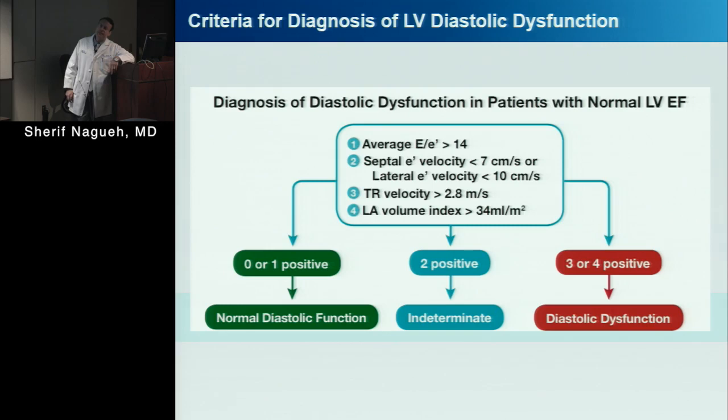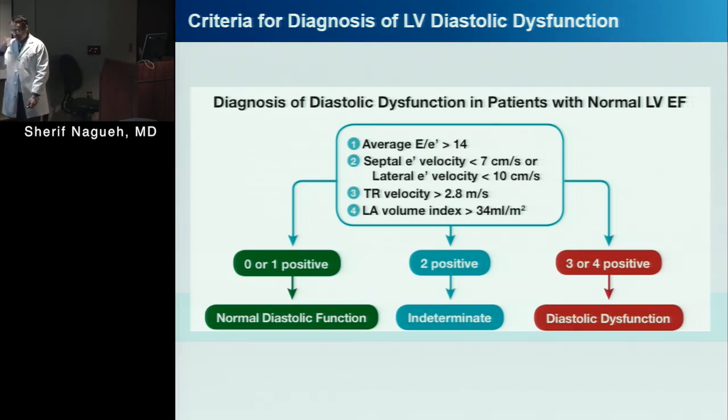The way I see that slide, that is not criteria for diastolic dysfunction. That's criteria for elevated filling pressures. So you have E prime, high TR velocity, peak LA, all of those things point towards high filling pressure rather than that. So you may have diastolic dysfunction with normal filling pressures. Correct. It has become more specific. So I understand the specificity. Yeah. But you have lost a lot of sensitivity of picking up people that have diastolic dysfunction yet don't have high filling pressures at rest, because these are at rest.